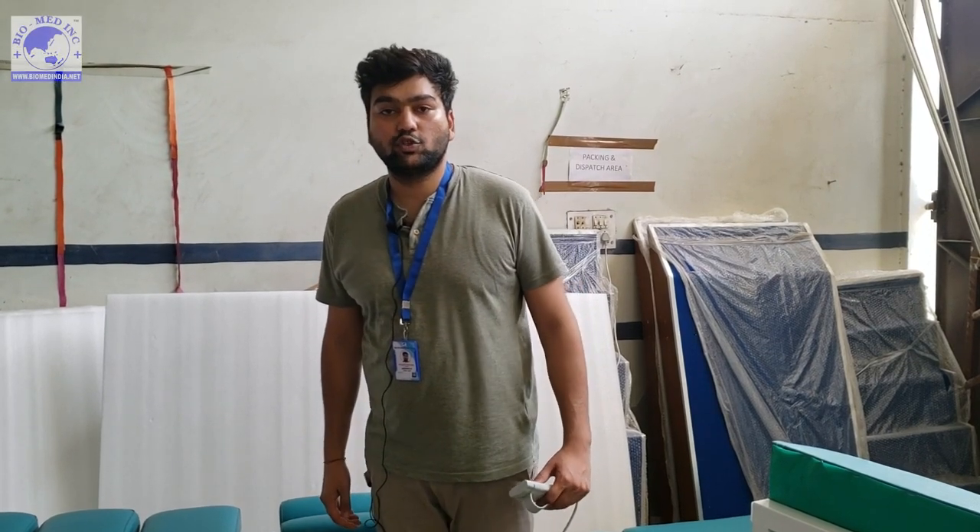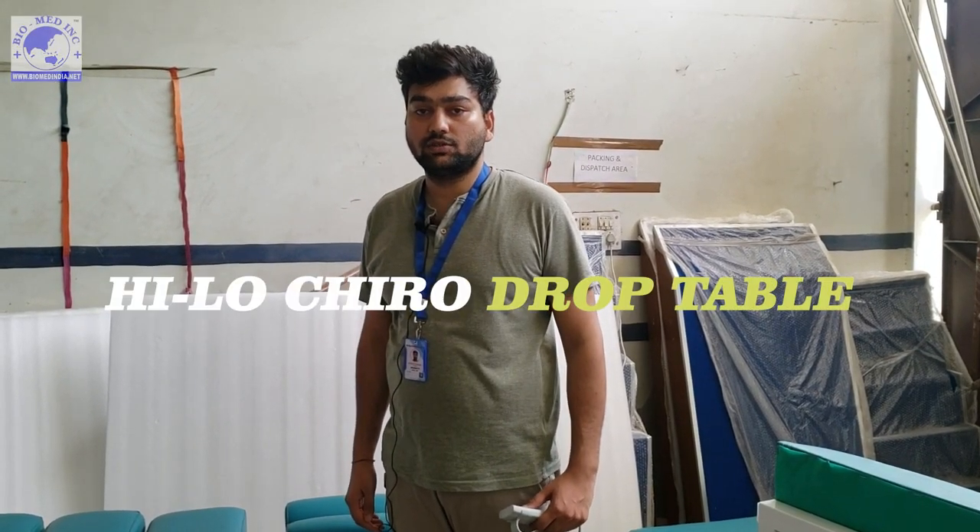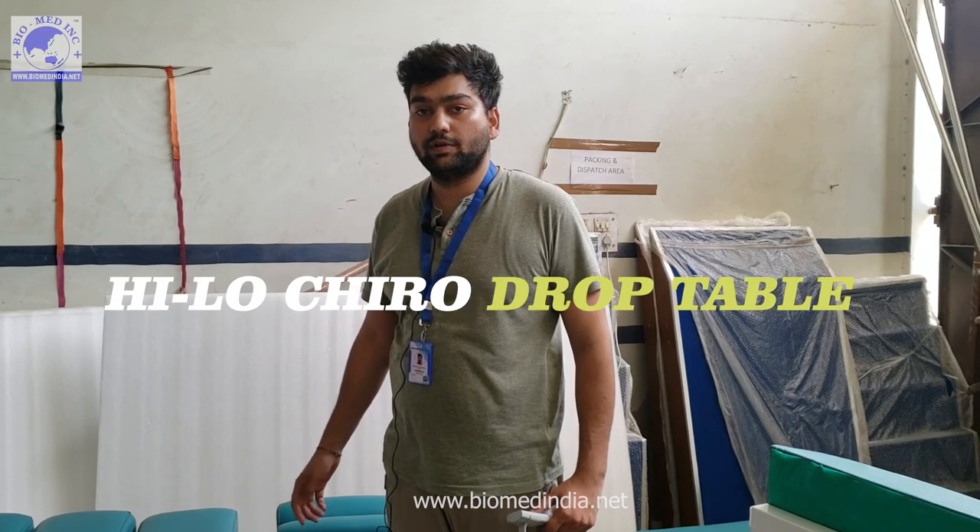Good afternoon everyone, my name is Piyush Panchal and today we will be showing you the Hi-Lo Chiro Drop Table. It comes with four drops and has various upgraded features which I will show you in this video.